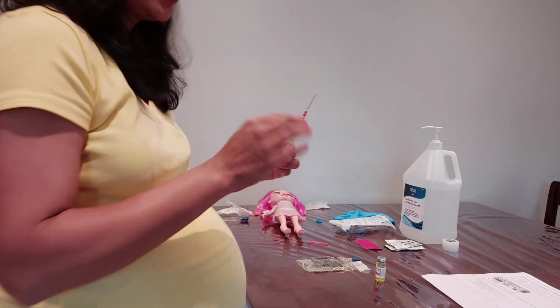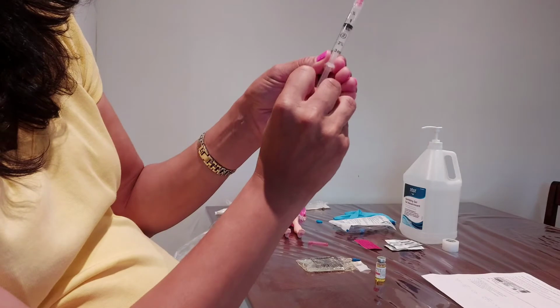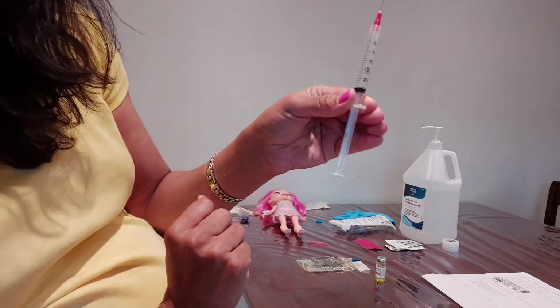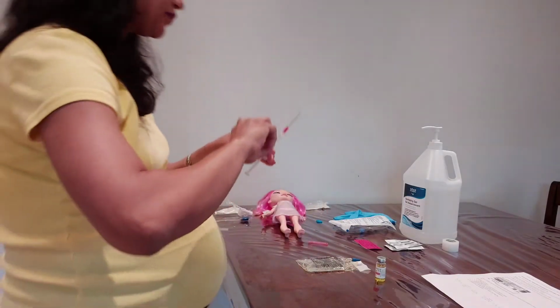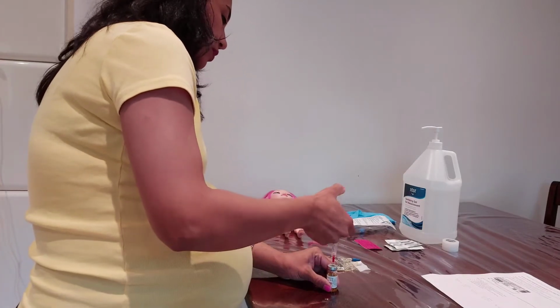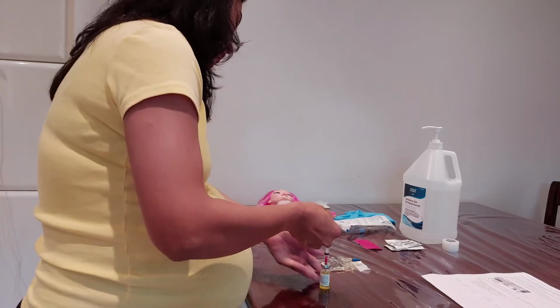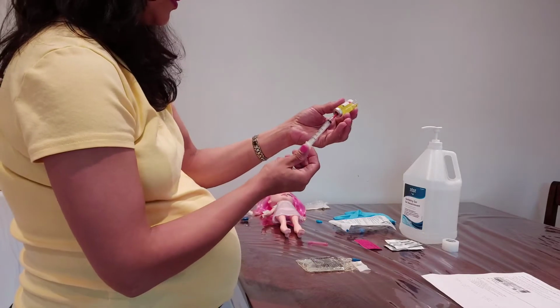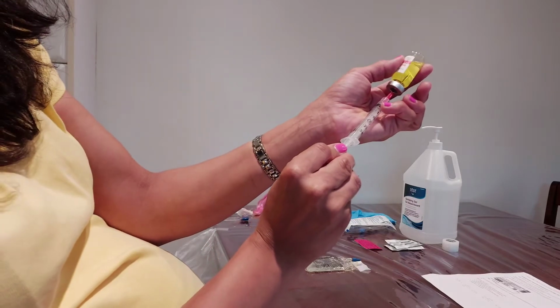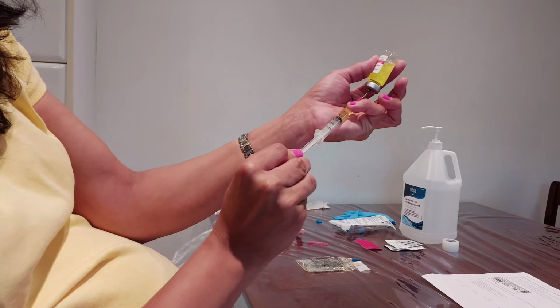I need 3 milliliters, so I will pull back about 3 milliliters of air. Then I will inject it into the medication. I will put the air in the medication, and then try to draw back 3 milliliters of the medication.